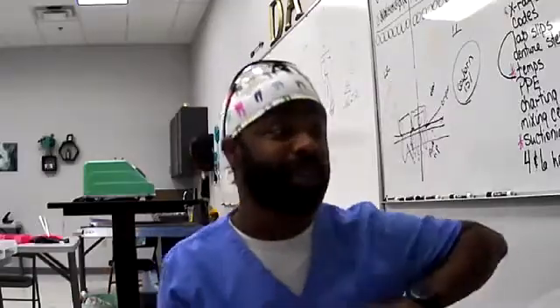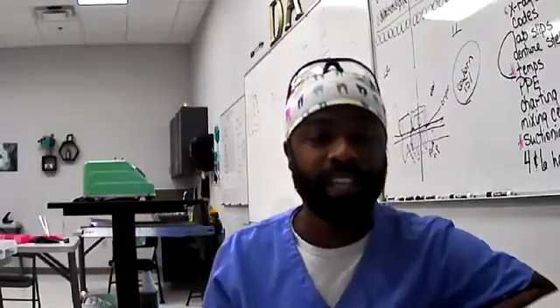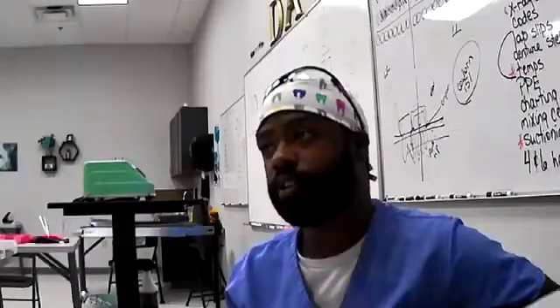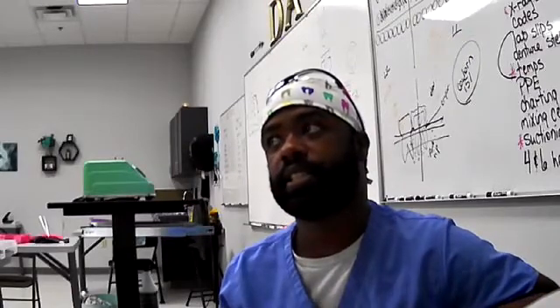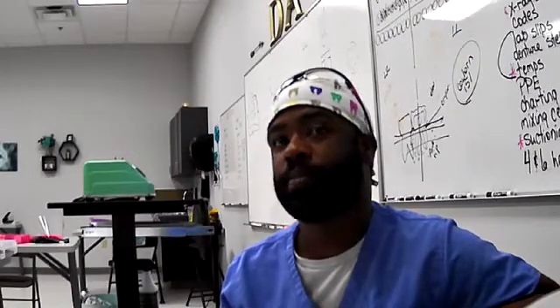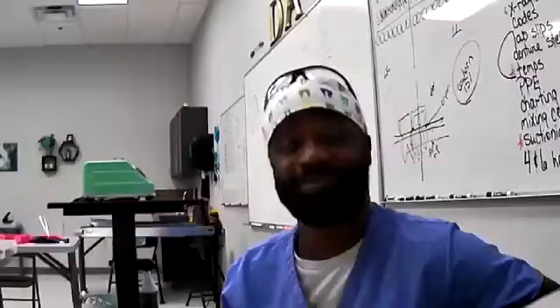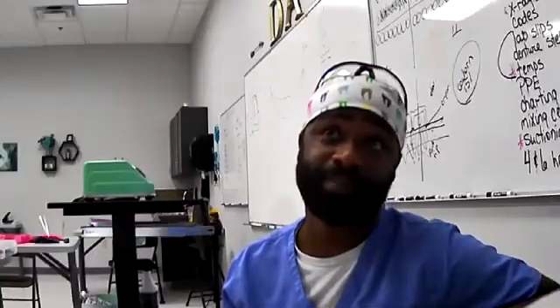But let's see. Tooth number 30. Would you use a mylar strip or the Tofflemire matrix band? The Tofflemire matrix band. Okay. Tooth number 6. Matrix band or mylar? The band. Wait, the band or the strip? Most likely the strip. Okay.